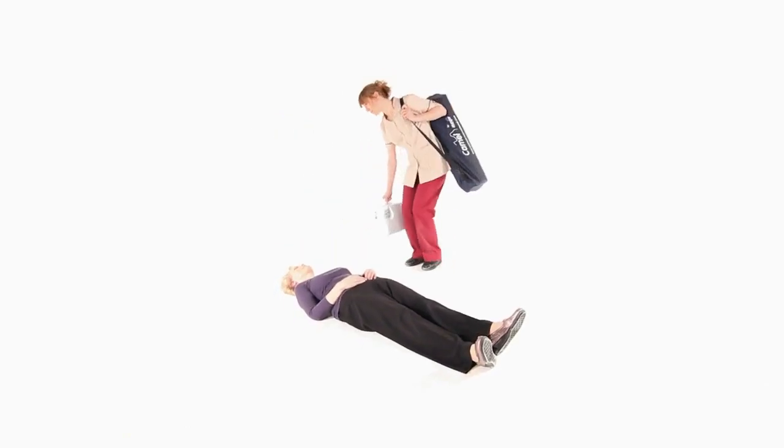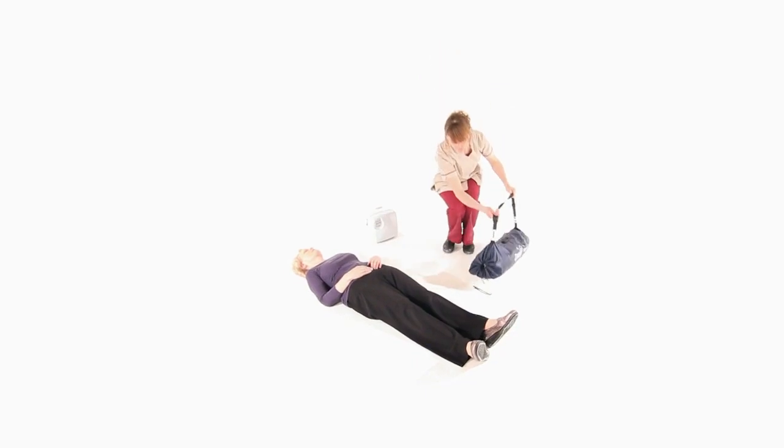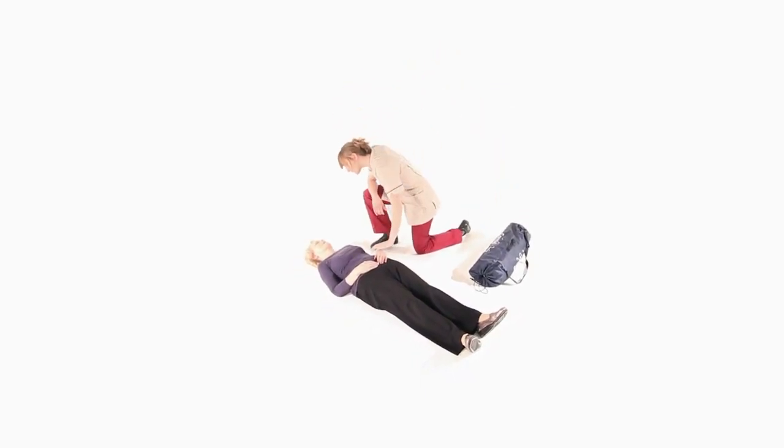In this scenario, a person has fallen and been found lying on the floor. The carer has established that no injury has been sustained, but the person is unable to get up without help.